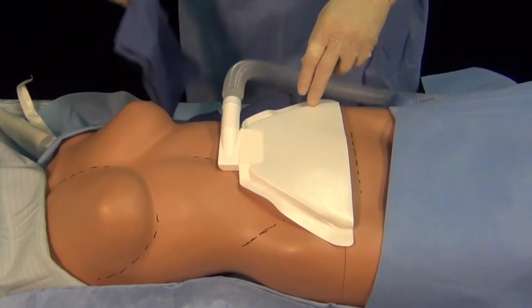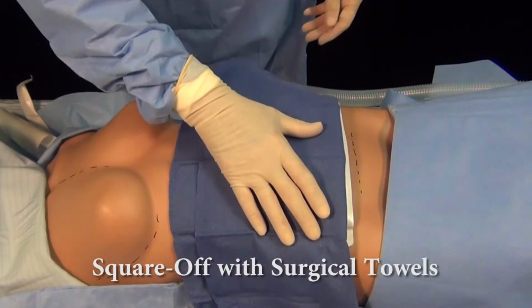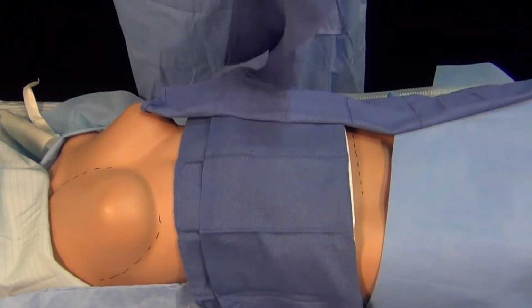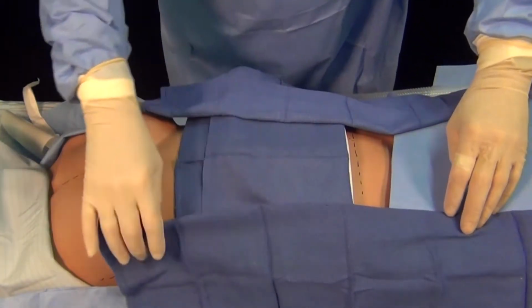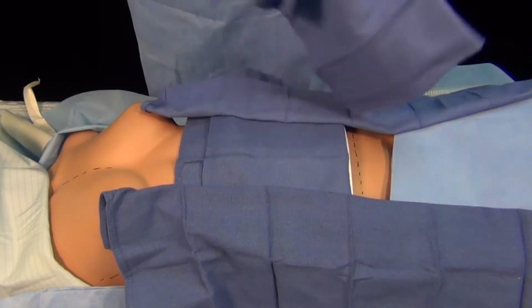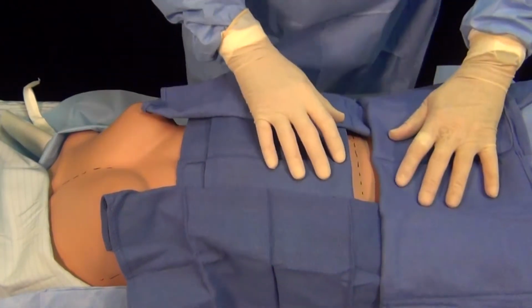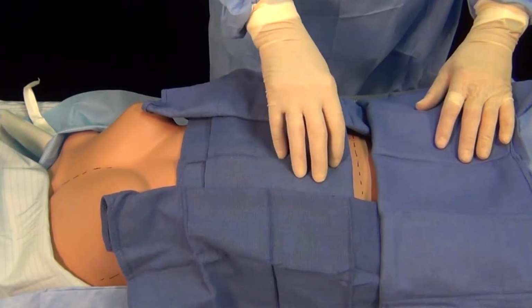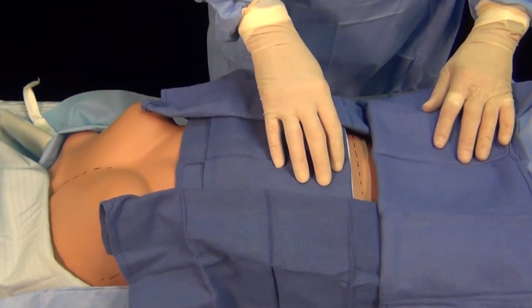At that point, then, it's a question of squaring off with towels in the usual way in which you do that. And you can see as the process continues, the device literally becomes almost invisible and will not distract you from your surgical procedure. Be aware that you can use any kind of retractor that you want to, either handheld or mechanical. As long as you don't compress the entire device, there will be adequate surface area to absorb the smoke and capture.